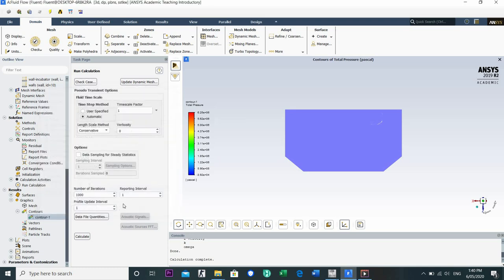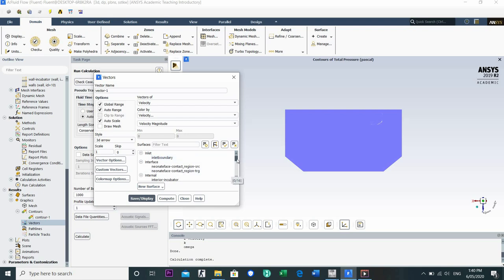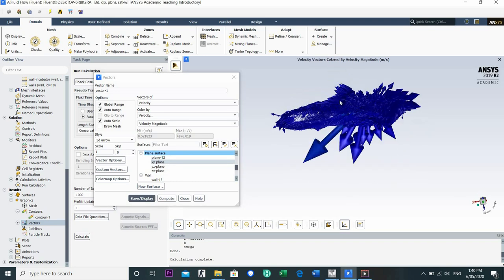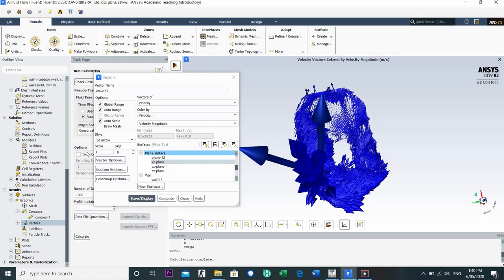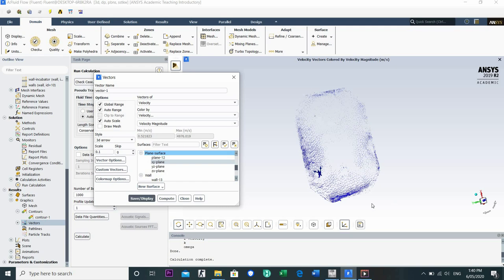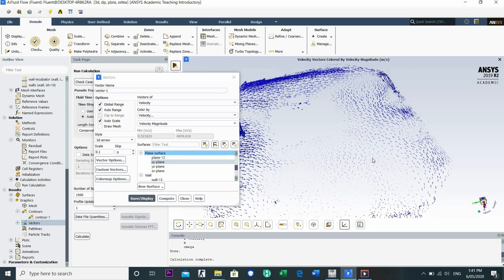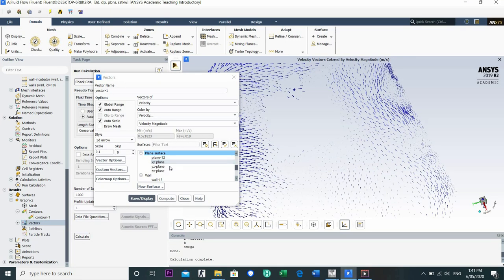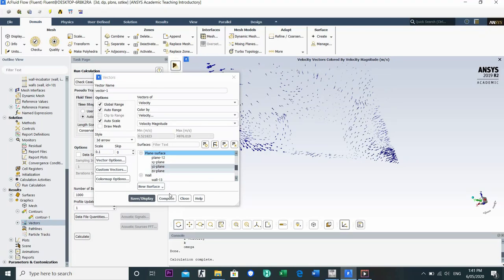Then after that, you can check the vectors. It would look like a velocity vector. Surface should be like that. This one, XY plane. As we can see, it looks like this. It's quite a lot, but you can change the scale from 1 to 0.5, and then save or display, or maybe a little bit lower, 0.1. Okay, it looks better, I think. You can zoom it, so we can see it like this. It would be the same for the YZ plane too, like this. And then the ZX plane also.